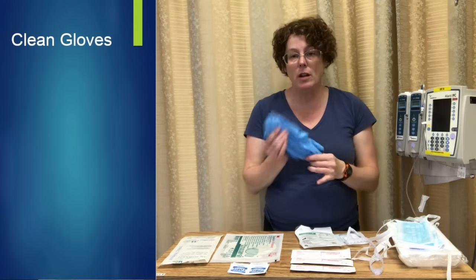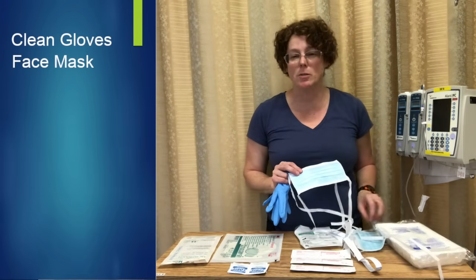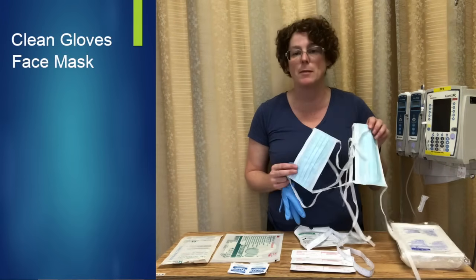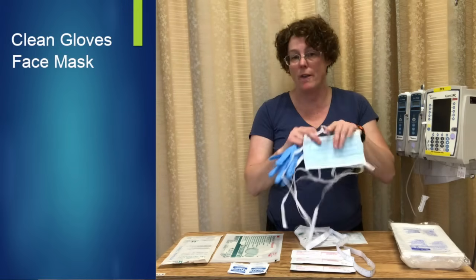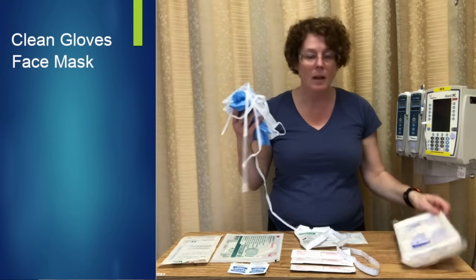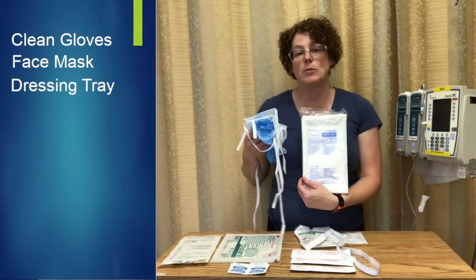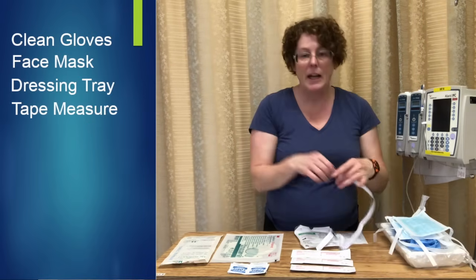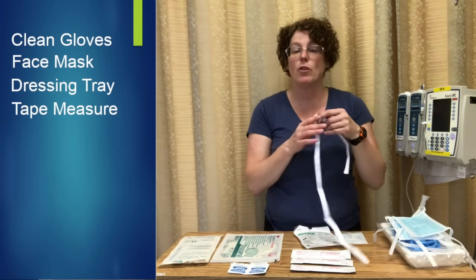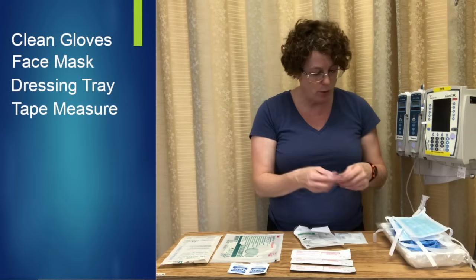I need a clean pair of gloves to take off the old dressing. I need a mask for me and a mask for my patient, because this is a long procedure and they sometimes like to talk — I want to give them a mask so they're not breathing on that area. I have a sterile dressing tray; you can do it with or without, and I will demonstrate both ways in this video. I have my measuring tape to make sure I have the correct length of my PICC line both pre and post.